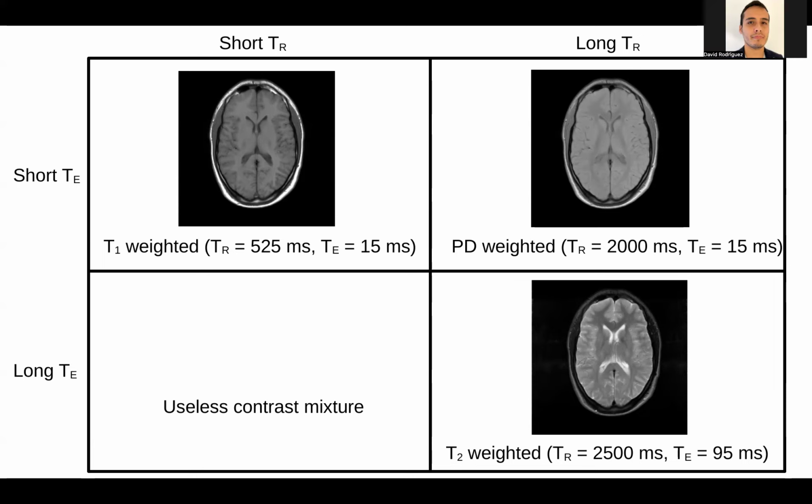Now, I don't know if I understand right, but in this last image, bottom right, just that one, you mentioned that you are using a contrast to image the cerebrospinal fluid. Is something additional that you have to put to prepare the patient or something like that? I don't know about this. Okay.